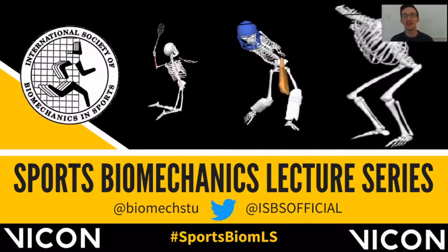I'm Stuart McErlain-Naylor from the University of Suffolk, and today I'm joined by Nick Gallimore, who is a life sciences application engineer at Vicon. And Nick's going to take us through a live motion capture demonstration, including live and post-processing, as well as real-time biofeedback.